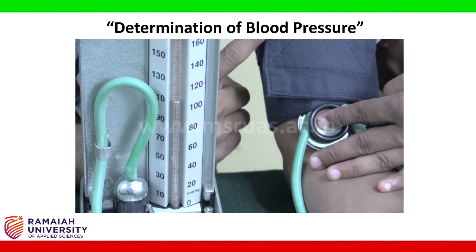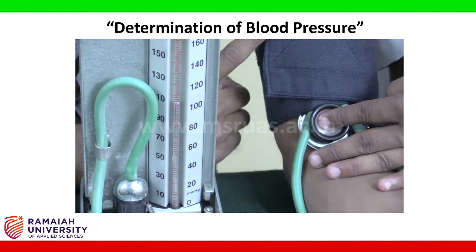When the sound disappears, note that as diastolic BP.